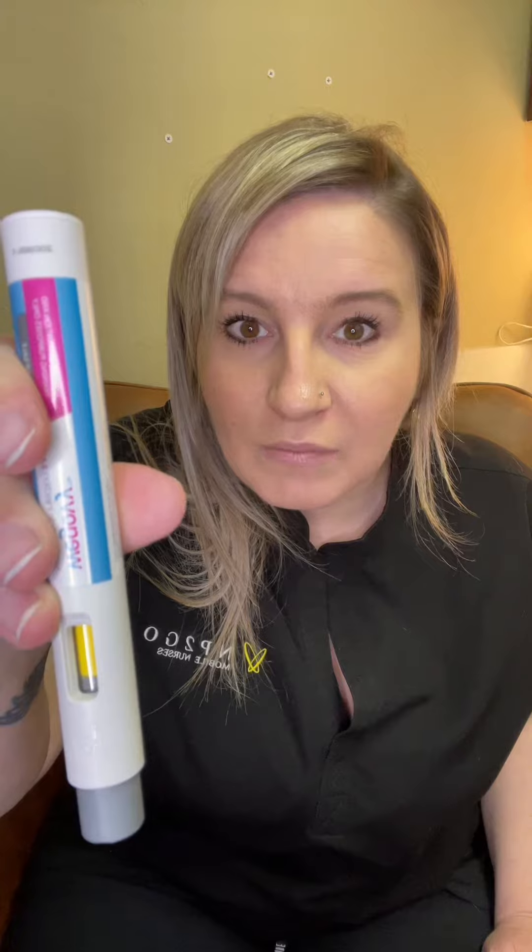So you'll hold it down, push it, and then wait for the second click. You'll also see the yellow in there, and that means it has been injected and finished. I like to keep holding it for 10 seconds just to make sure everything's done right.